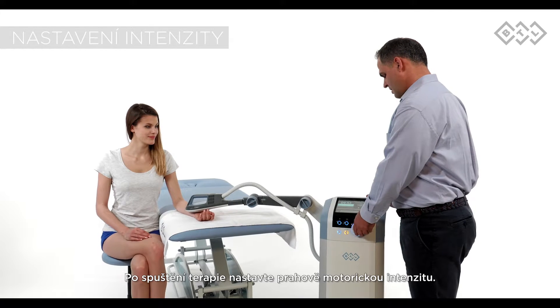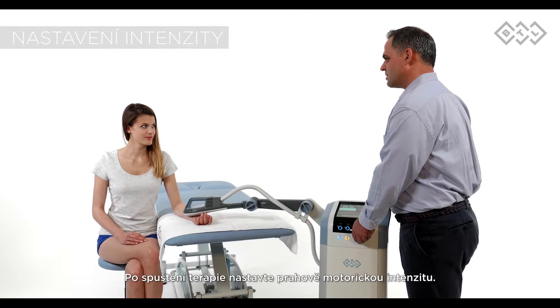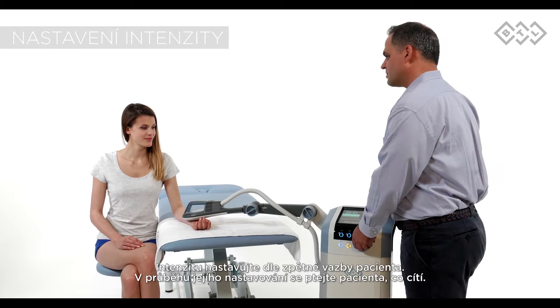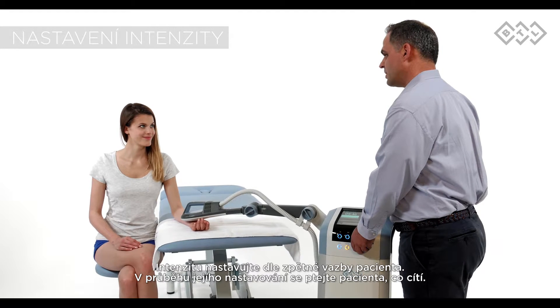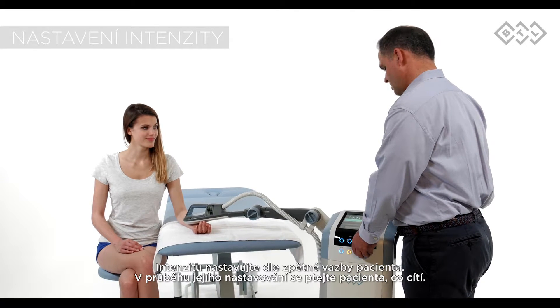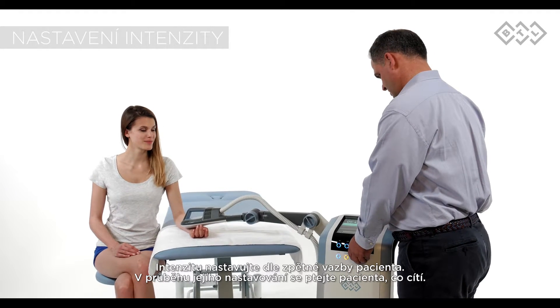After pressing start, adjust the intensity by turning the knob to motor threshold level. While doing so, keep verbal contact with the patient in order to set the right level of intensity.